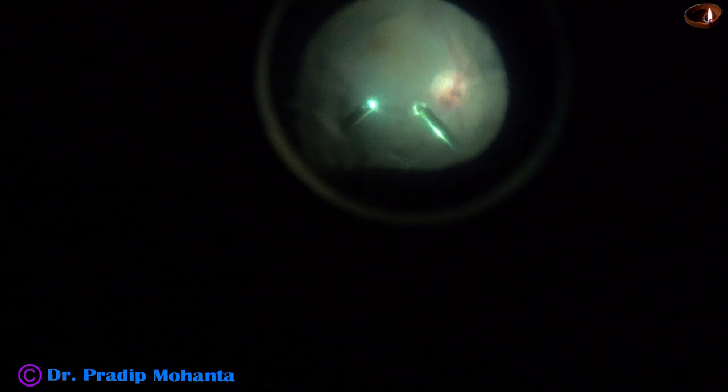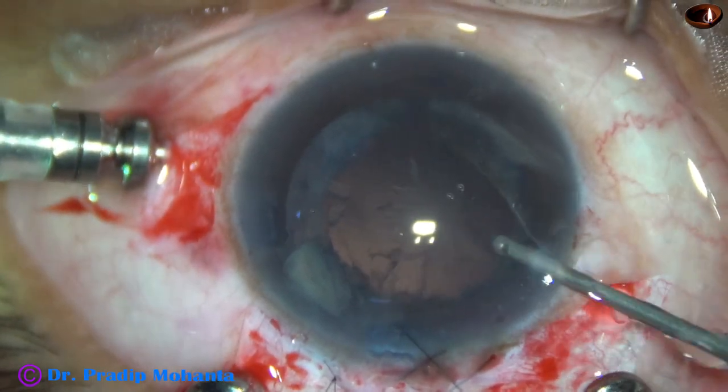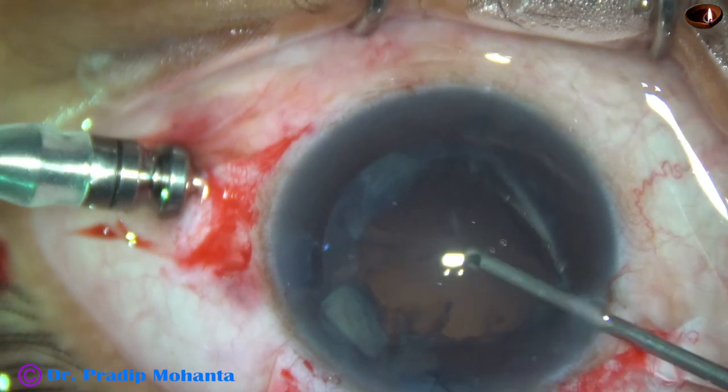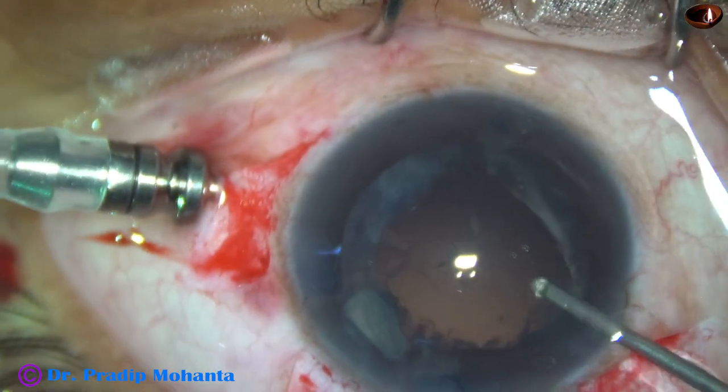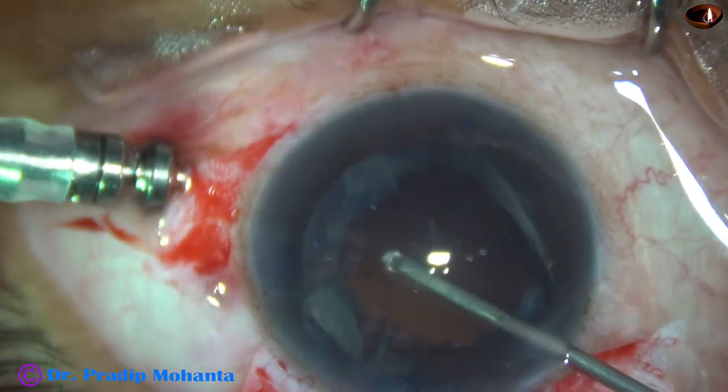We don't need any ultrasonic energy to emulsify the epinucleus in such cases. But if nuclear pieces are present in the vitreous cavity, we need to use ultrasonic energy to emulsify them, and in those cases we need to do thorough vitrectomy. But when we are using the cutter, if we can manage by core vitrectomy, it is fine.